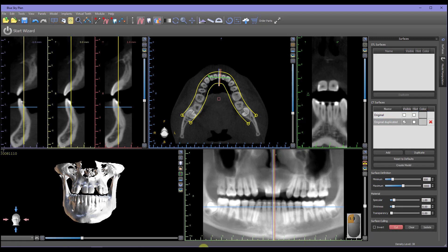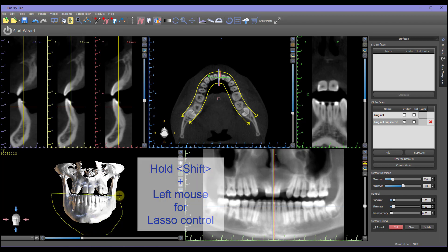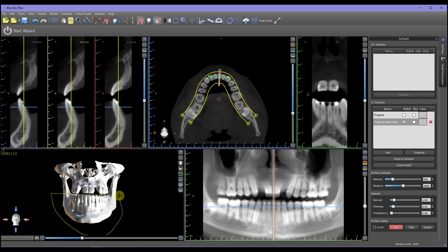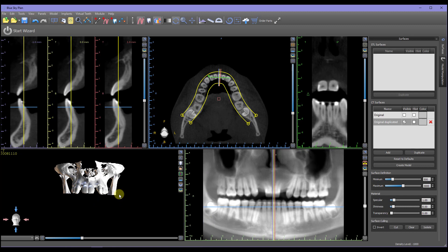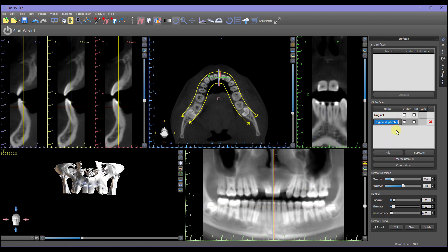Left-click on the Cut button, move the cursor to the 3D view, hold the Shift key and the left mouse button in order to drag the lasso around the mandible. Release the left mouse button and the mandible is now cut. In the Surfaces panel, double-click on the name Original Duplicated and key in Maxilla.